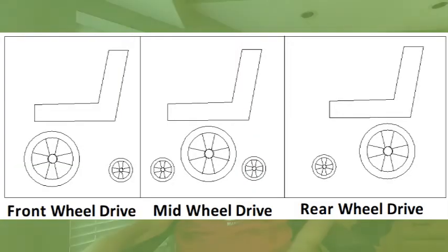Seat elevators on some older power chair models were very slow operating, taking 45 to 60 seconds to raise the seat 10 inches. That might have been good for safety concerns, but is a serious source of displeasure when the user needs to do something fast, like get transferred to a toilet. The older chairs also did not have the ability to raise or lower the seat while moving, and some models seriously restricted the speeds at which you could drive when the seat was even just slightly raised. If you have IBM and Mother Nature calls, a fast elevating seat that can be raised while driving to the bathroom is often appreciated. Let's start with the three different drive types available on power chairs.